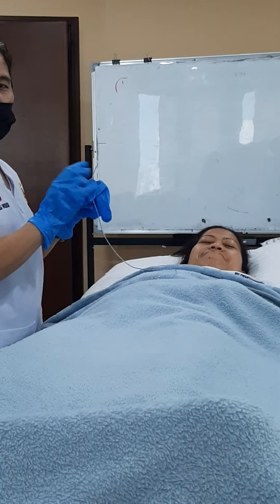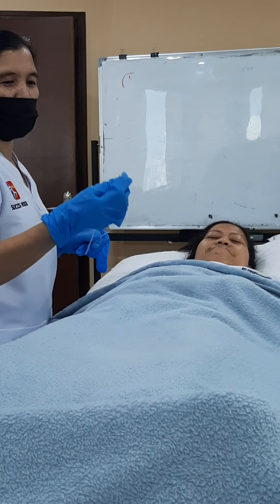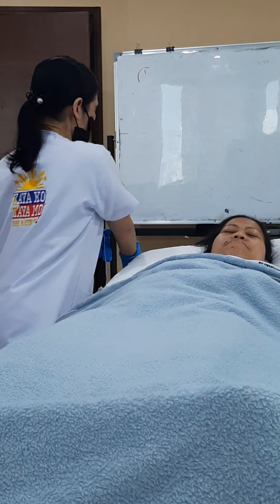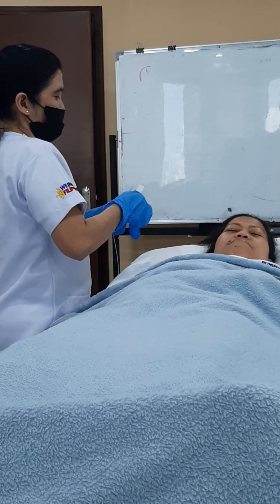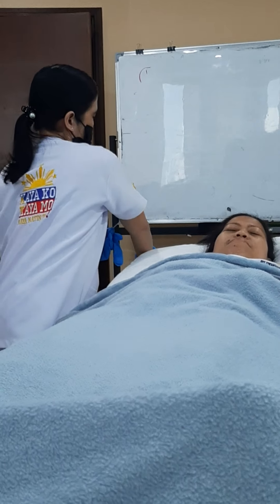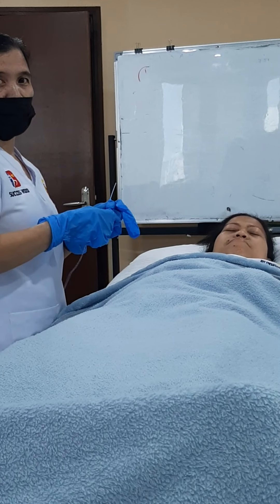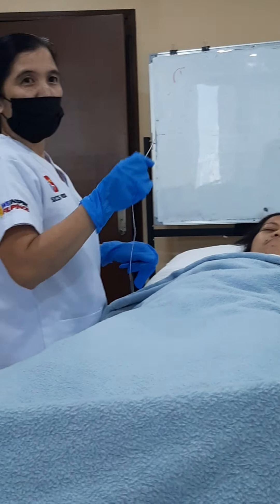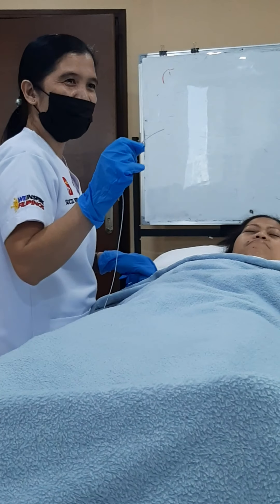We're going to do the demo. So be sure to close this one after the exam. We can't tell you. Classmate, we're not going to insert the NGT — only to clean the NGT.